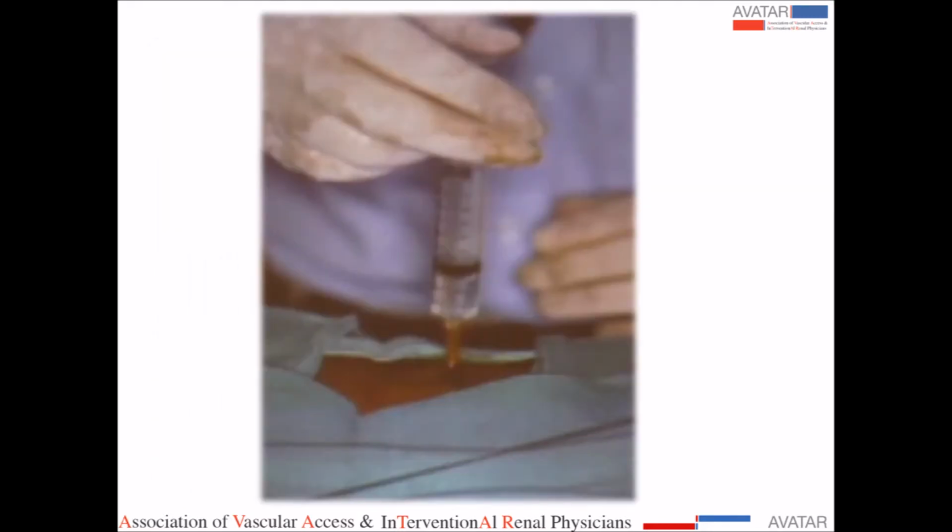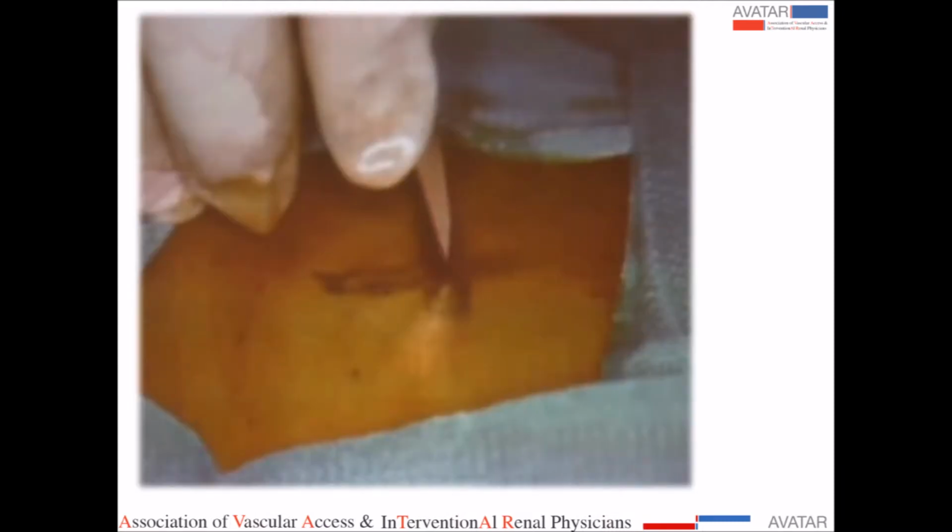Now keep in mind that when we measured it, it was around 5 centimeters. When you inject the lidocaine, you're going to have another half to 1 centimeter below it. And then a small incision for the biopsy needle or the biopsy gun to go through.